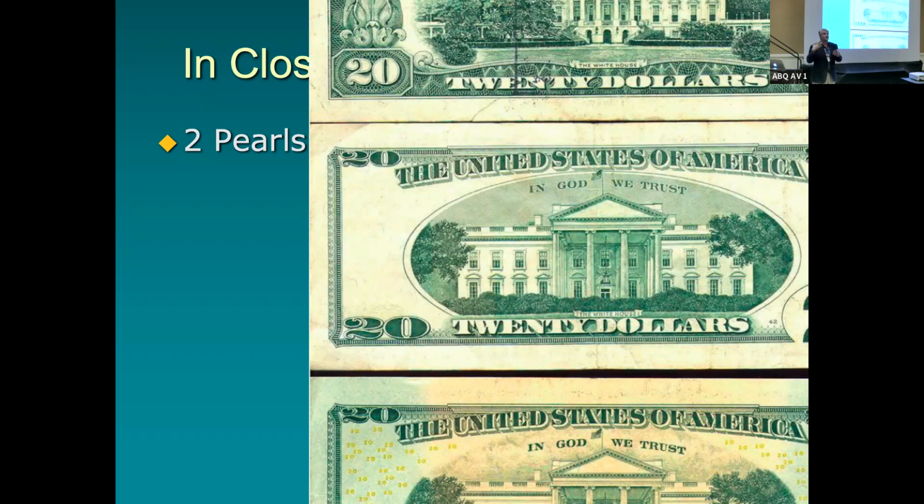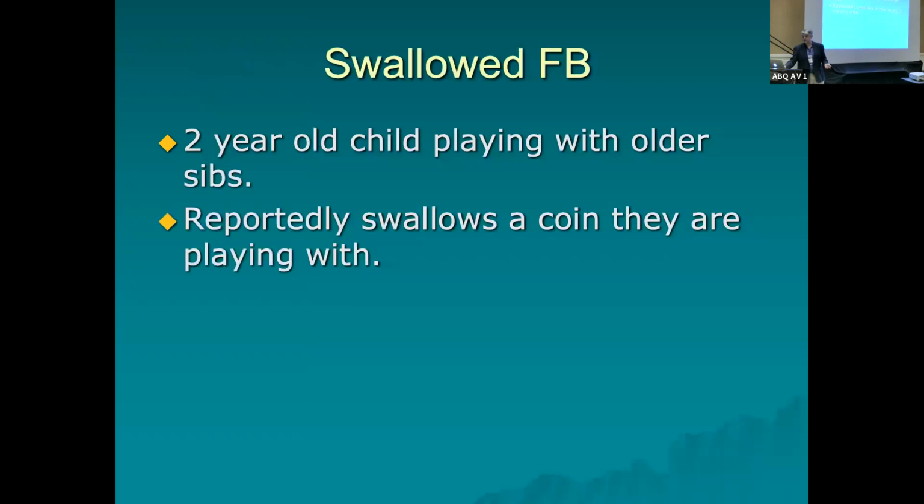So learn to appreciate x-rays, even normal x-rays. Go to your hospital, talk to the radiologist, look at x-rays, let them point out pearls to you. Learn to value what is normal. And when abnormals present to you, they stand out very easily.